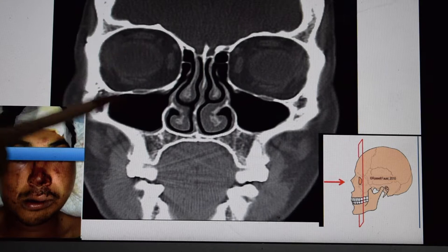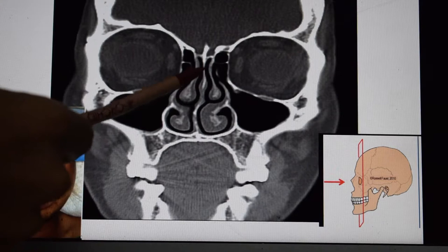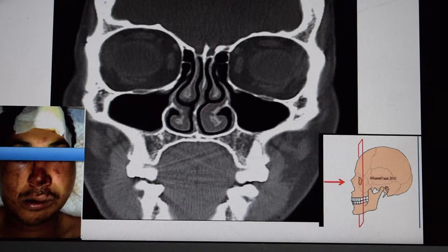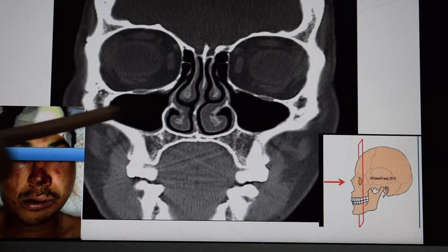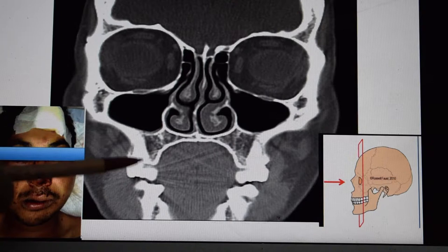This is your nasal bone, which is also intact. The midline structure is your nasal septum, which is slightly deviated — we cannot tell the reason because sometimes it is deviated due to a congenital problem or because of a fracture. These black parts are your maxillary sinuses beneath the cheekbones. This is your cheekbone, known as the zygoma, and this is the mandible. This is the normal CT scan.